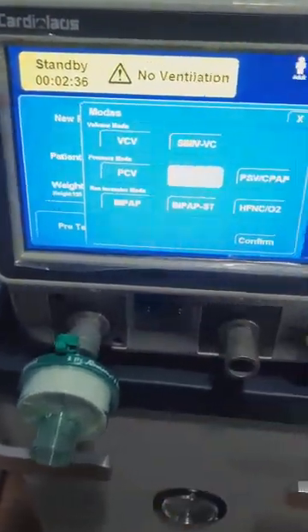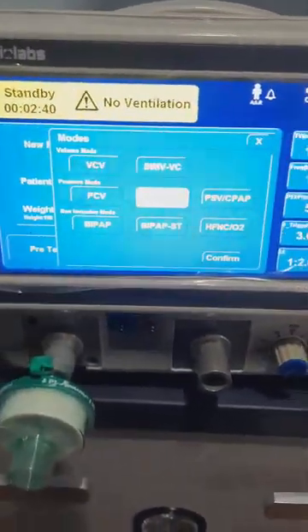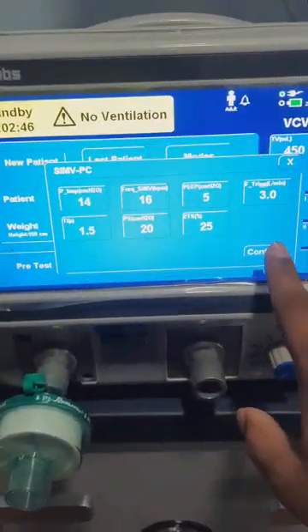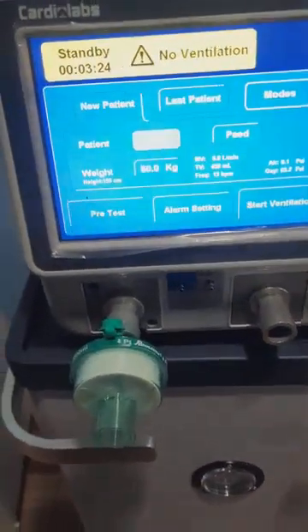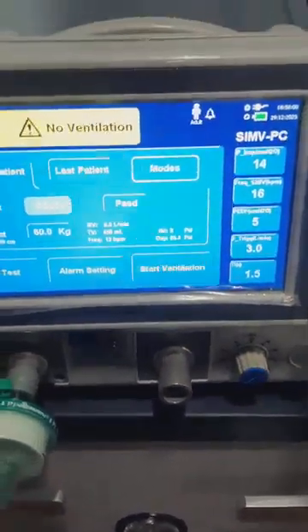The mode we choose depends on the type of disease the patient has. For an emergency patient we would typically choose pressure control, select it, and confirm. Moving on, we will now start the compressor. Before that I would like to show you something — we have connected the airway inlet.